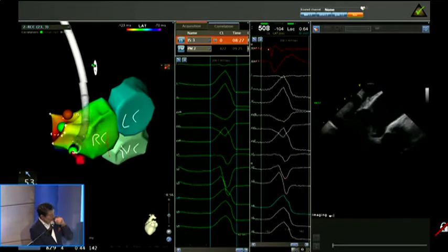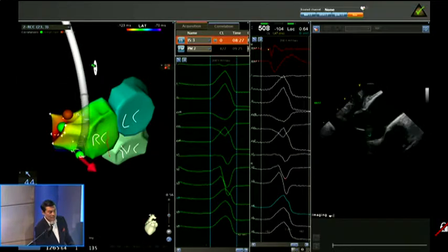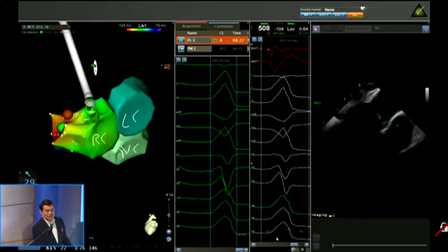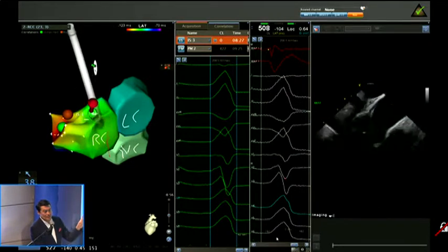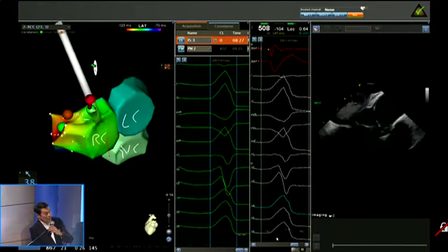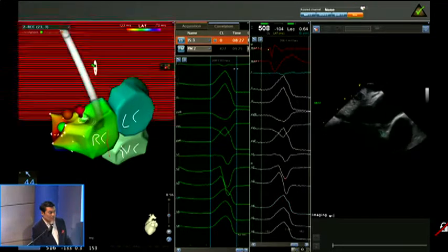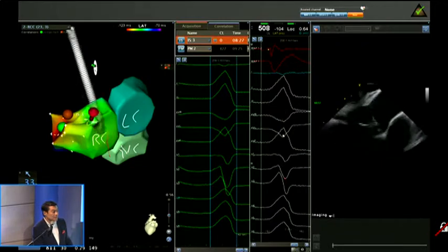Diego, let me convey the comments from the room so that you can make your own comments and replies over there. So you are all in favor that you would have gone first to the right side to do the mapping. There's another comment, and we'll go back to you in the lab.